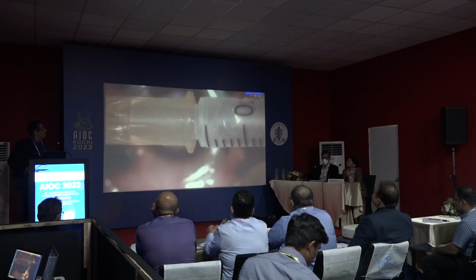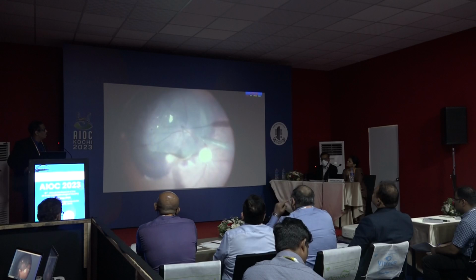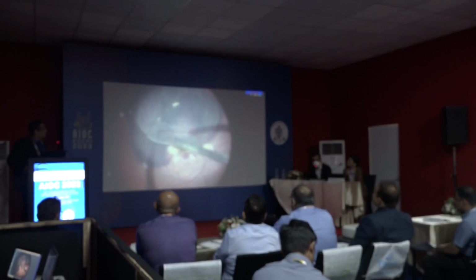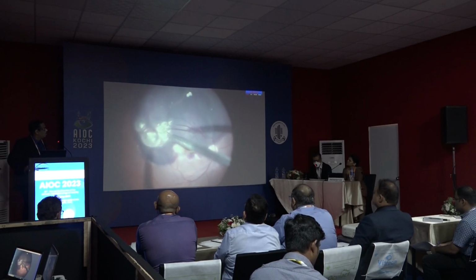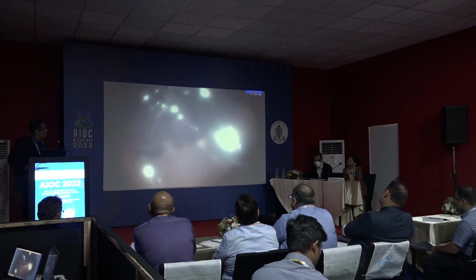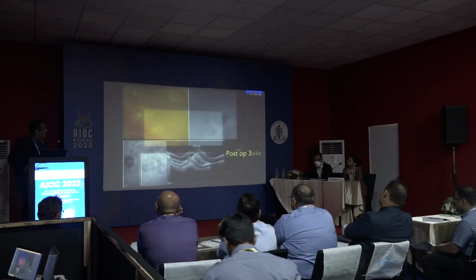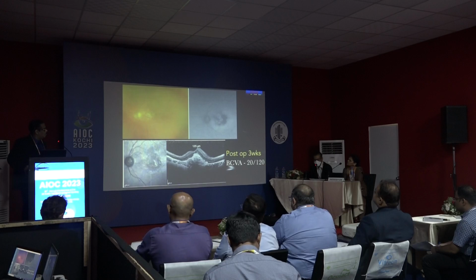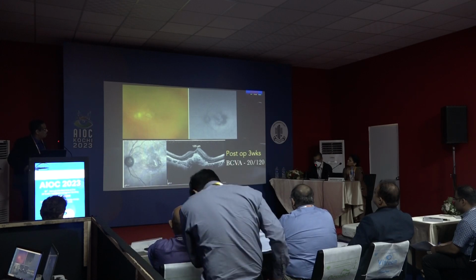Again, I have used a combination of anti-VEGF ranibizumab injection 0.05 ml and filtered air 0.03 cc and injected slowly in the subretinal space outside the macula. Then I completed fluid air exchange and used sulfur hexafluoride gas tamponade. After 3 weeks, best corrected visual acuity improved to 20/120, with significant reduction of submacular hemorrhage with CNVM remnant only.